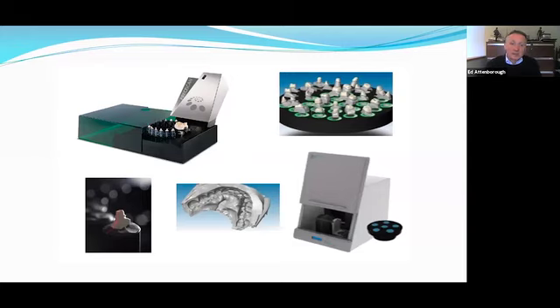And the way that it works is that a laser beam, in this case, is projected on the object that wants to be scanned. So if you have a look here, I think you can probably see my mouse pointer at the image bottom left. There's a die there, and we're rotating that die under a laser beam, and the laser beam casts a profile on the die. In this scanning arrangement, it's a fixed angle of scanning.